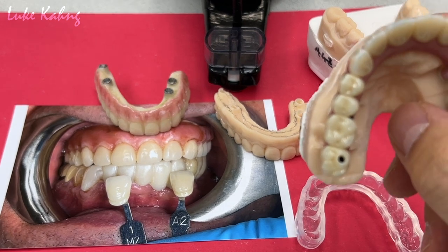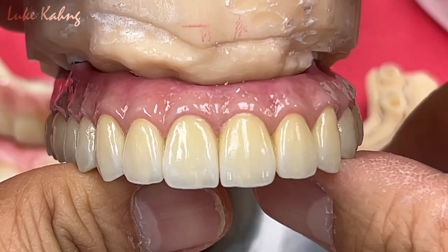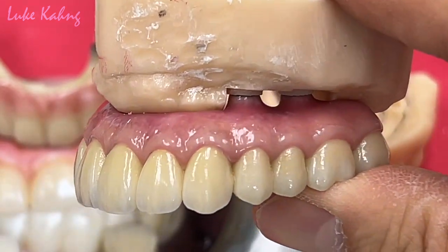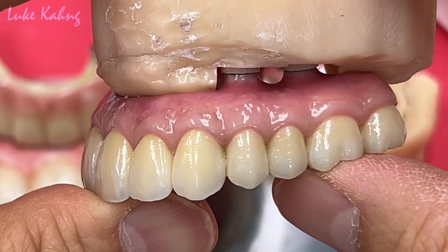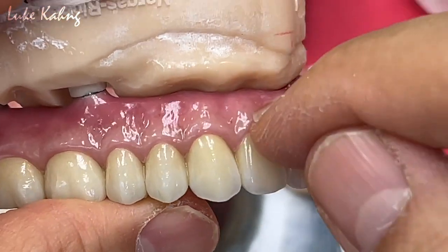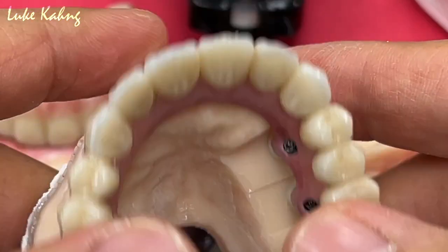After cementation. Regarding cementation, you can see my previous video. There are a lot of cement techniques which I already published with a video, and you can watch it. How I do it with the fast setting, and this is where I need some fast setting compared to slow setting. One is the finals, full mouth restoration.